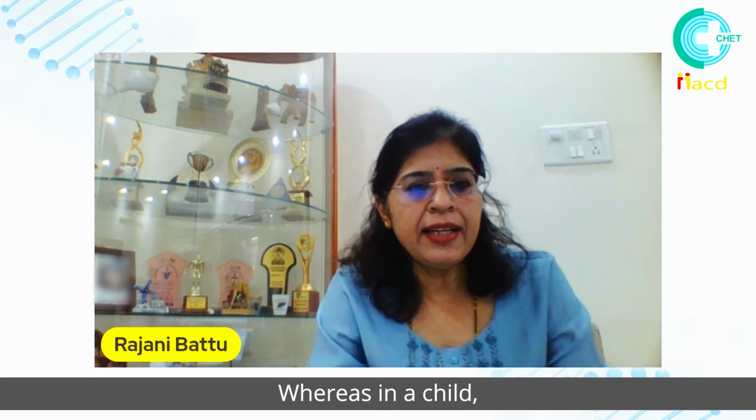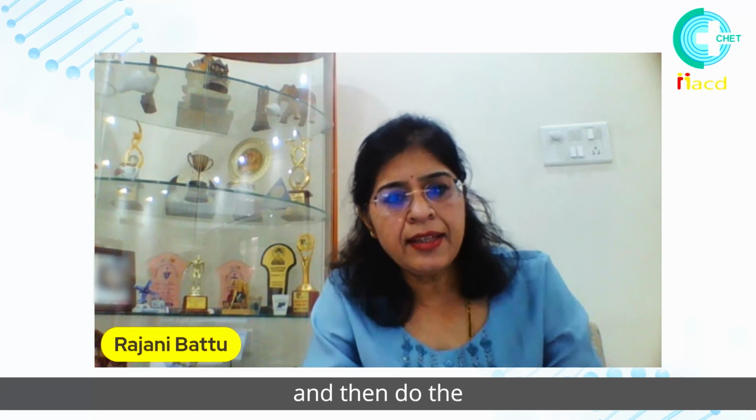The trouble is only with LCA, where sometimes we have to do an ERG under anesthesia. Because in an adult, an ERG is done in an outpatient setting, whereas in a child, we may need to give the child general anesthesia and then do the ERG. So that's a little bit challenging. Those are the ways that we really diagnose what is happening clinically. This is now called the phenotype. Whatever the clinical information is in a given person, we call it the phenotype.